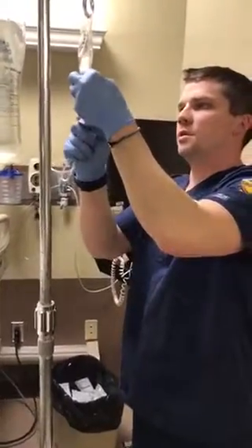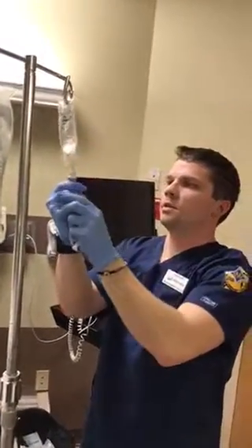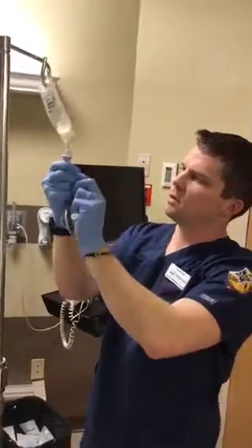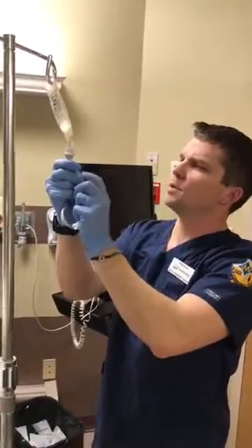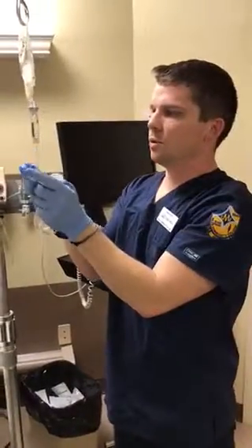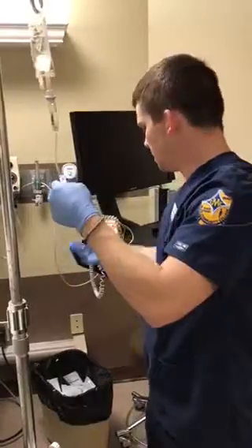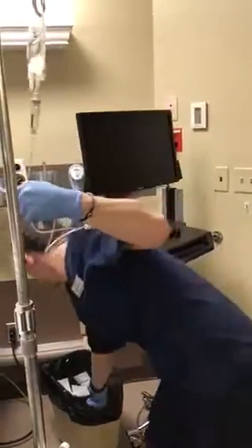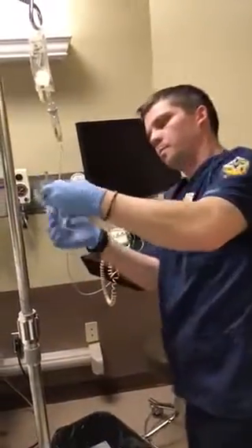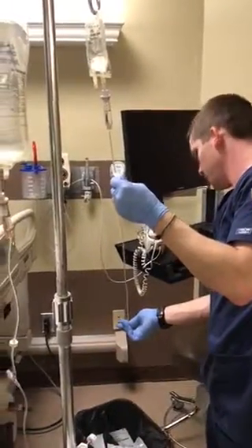Remove the protective cover and using aseptic technique, introduce that and fill up the drip chamber. Drop the drip chamber down. All right. Go ahead and prime the tubing.